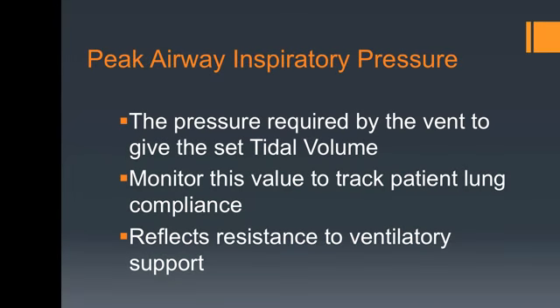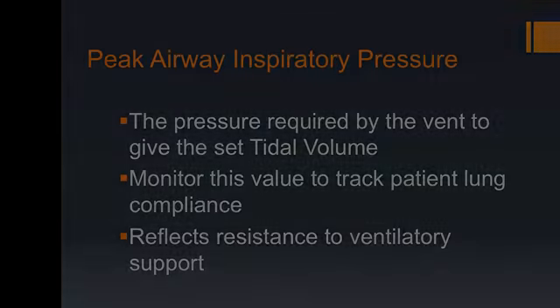Then we have peak airway inspiratory pressure. This is the pressure required by the ventilator to give the set tidal volume. This value is monitored by the nurse and respiratory therapist and physician to track the patient's lung compliance. It reflects resistance to ventilatory support and is monitored throughout the time of intubation.